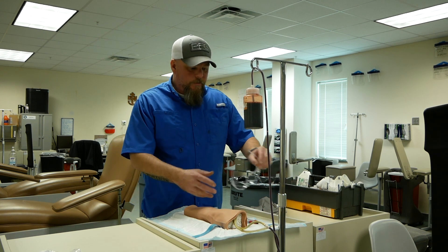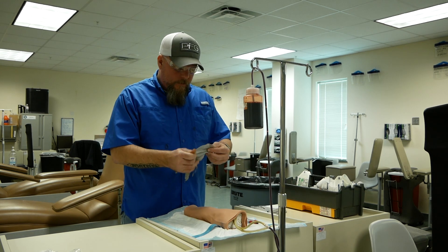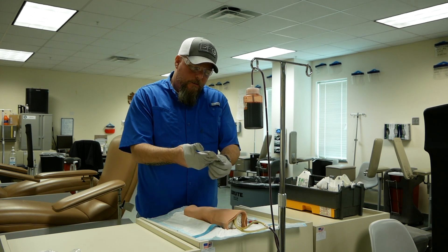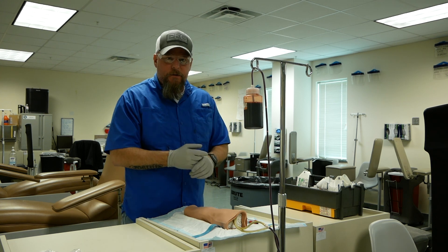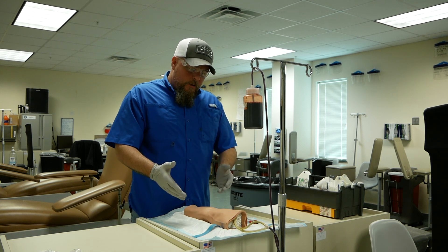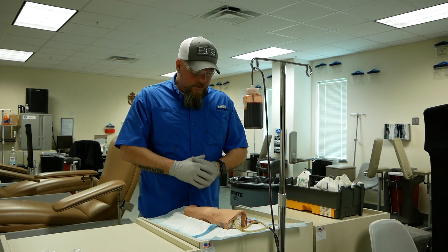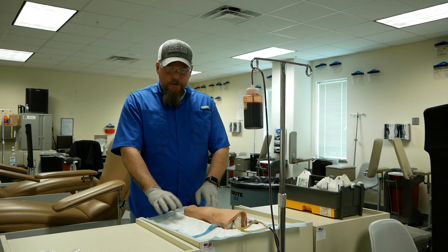Your BSI is going to include a face shield — I'm just going to put on some goggles and gloves. After you wash your hands and don your BSI, you're going to provide your patient privacy and ensure that they're comfortable. The next thing we're going to do is inspect an arm for a good vein, which means there's no lesions, bruising, edema or swelling that would prevent you from being able to see the vein. We're going to verbalize that we would place an absorbent pad underneath our patient.